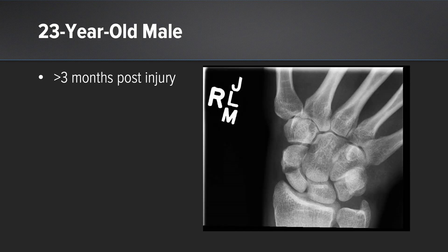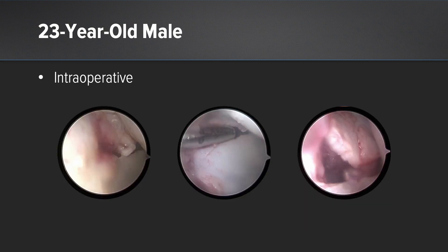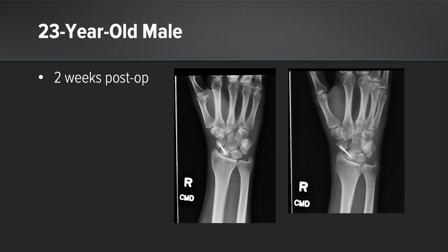Next, I'm going to talk about a variety of cases that I have performed this way. The first is a 23-year-old male, greater than three months post-injury, where you can clearly see reabsorption of the scaphoid at the fracture site. Intraoperative dry arthroscopy images show the non-union site, followed by debridement of the site, and then the appearance after inserting a biosurge and a headless compression screw.